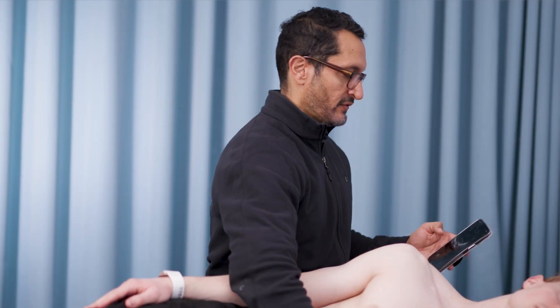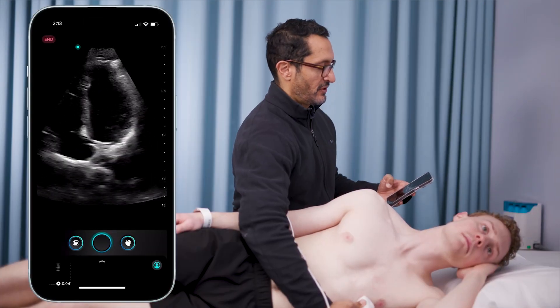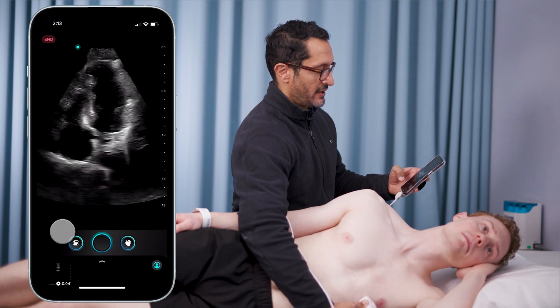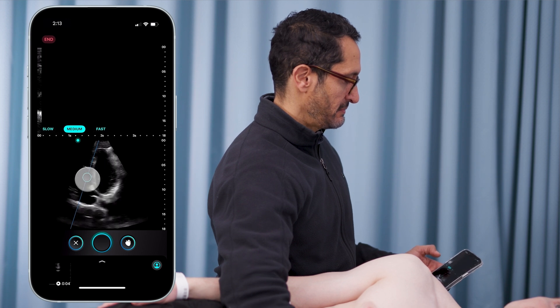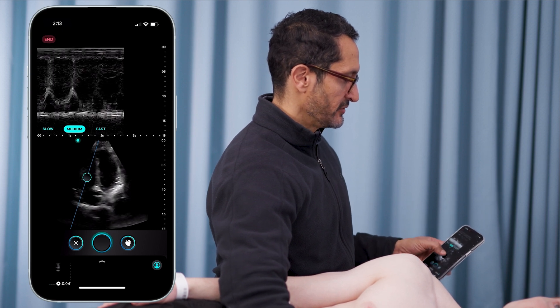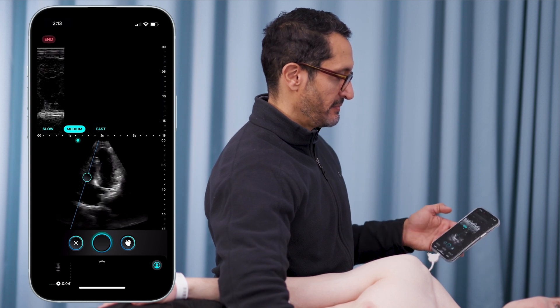The next view I'm going to go to is the apical 4. From this view I can do pretty much anything — I can get my parasternal long axis, I can get my apical 4 axis. Beautiful views, crisp imaging, with AI assistance right away. If I want, I can use my M-mode. I'll hit motion and slide my gate. I can change from slow to fast — really easy to do. All intuitive, all built around the user, built around the clinician that's not comfortable with ultrasound, in a way that makes sense to everybody.